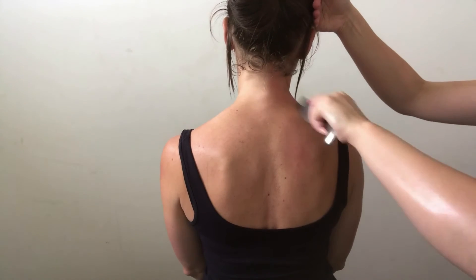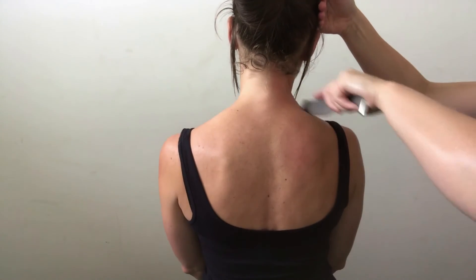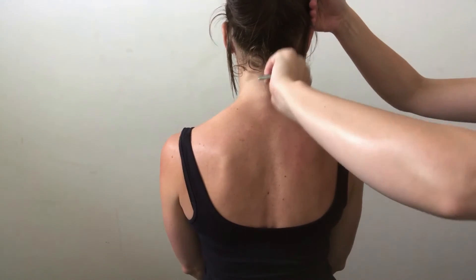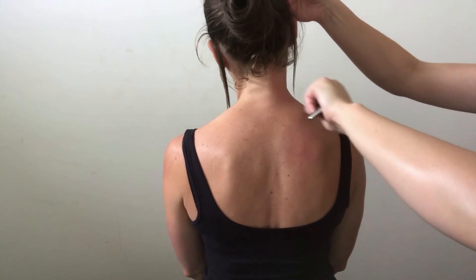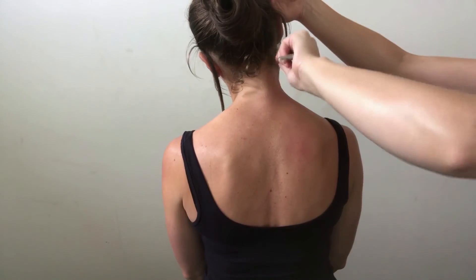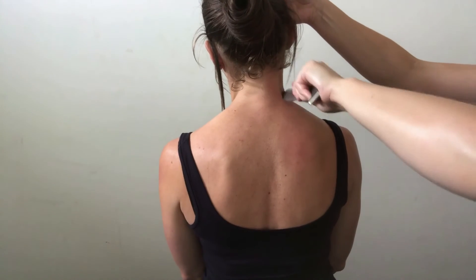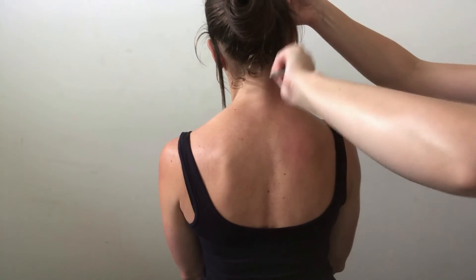You can also take an MET in that position, so contracting the muscle that you're using the tool on and then taking the stretch over, or contracting the opposite muscle and then using the tool on the same muscle that you're trying to stretch.